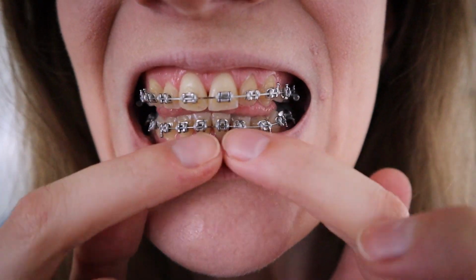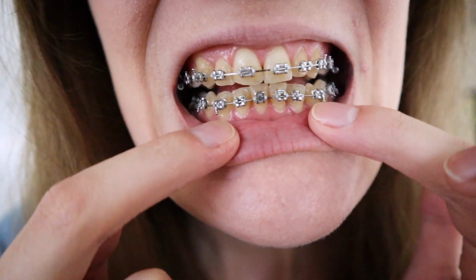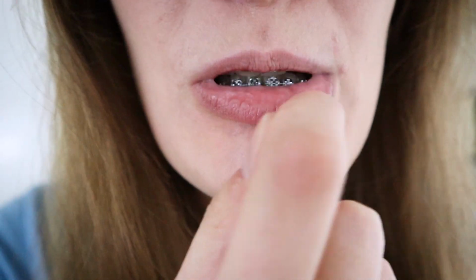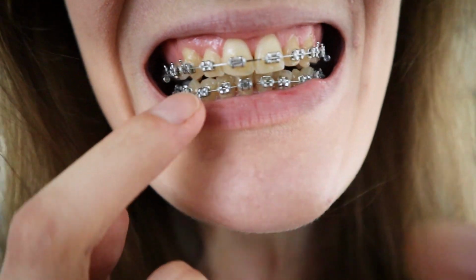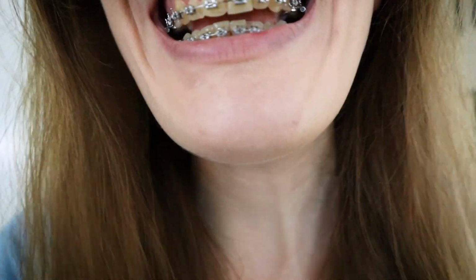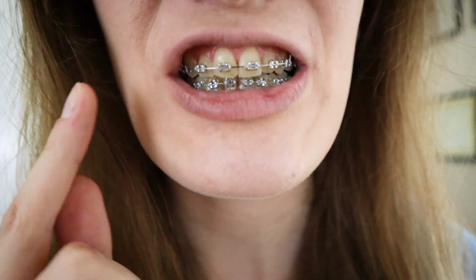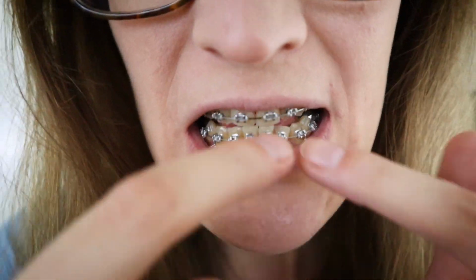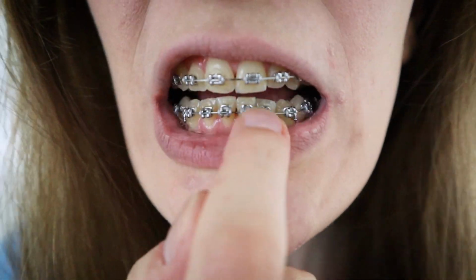So the bottom really is where everything is happening right now. And if you notice too, I have some sores on my mouth from my braces. They've been rubbing up against my lip. That's what that is. But my teeth are doing pretty well. And the top is pretty straight, they're really not doing anything yet up here. And as you can see, I got the pearl brackets. They kind of look silver, like white, but it's actually pearl. And the bottom, I'm going to show you guys inside a little bit more in just a second, is straightening out. This tooth here is finally cooperating, at least a little bit more than it was before.